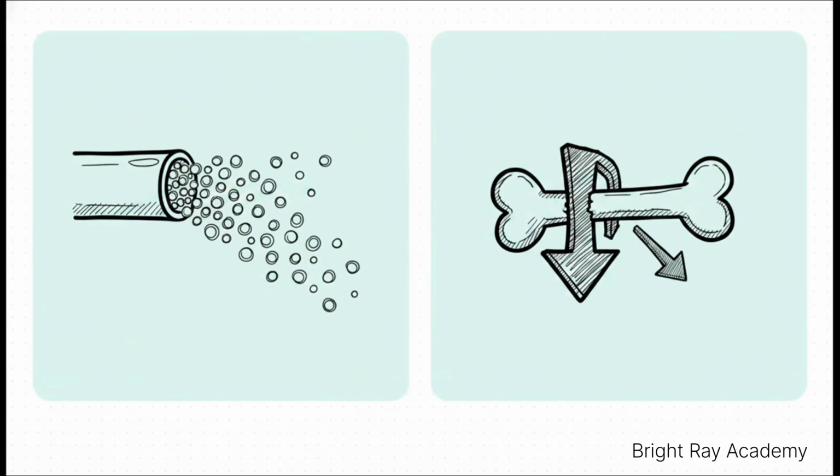It basically boils down to two distinct concepts, quantity and quality. Radiation quantity refers to the pure intensity, the actual number of X-rays in the beam. We control this with milliamperage, or mA. Radiation quality, on the other hand, refers to the penetrability, or the overall energy of that X-ray beam. Like, can it pass through dense bone or just soft tissue? That is determined by the kilovolt peak, or kVp. Simply put, quantity is how many, quality is how strong.